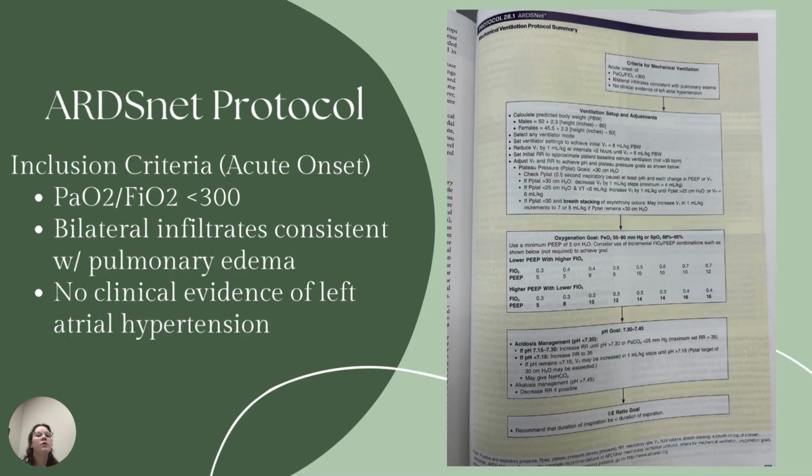So the ARDSnet protocol, that picture I posted right there is from one of our textbooks. I'm going to go over some of the things listed on it in a little bit more detail.